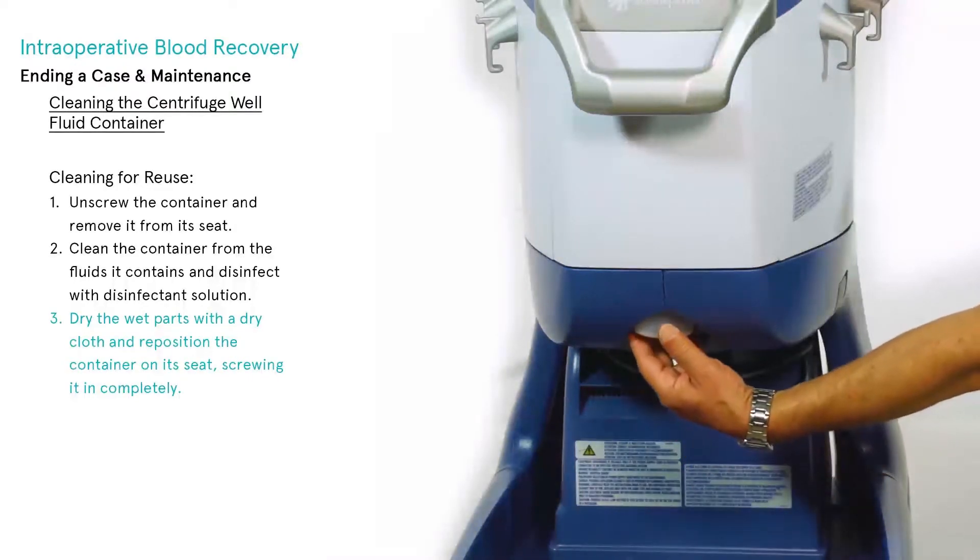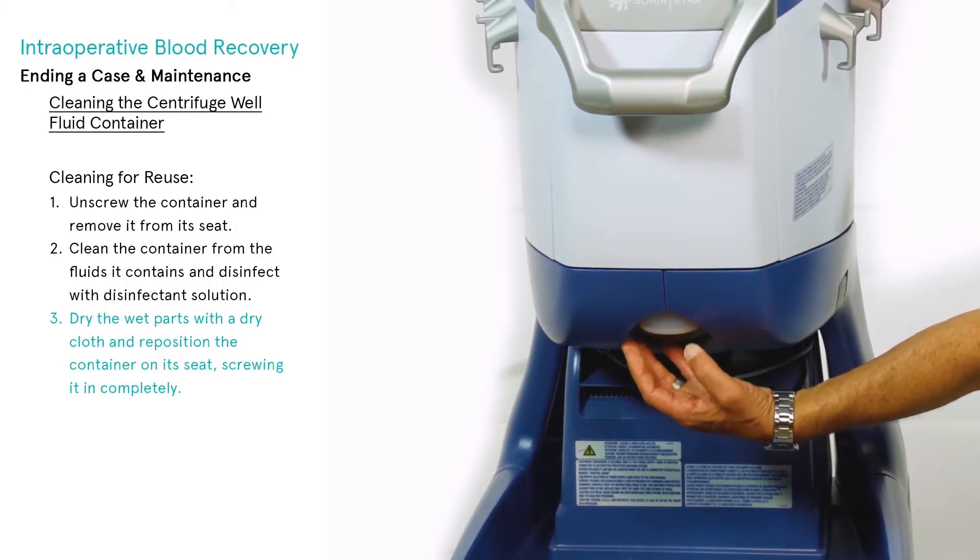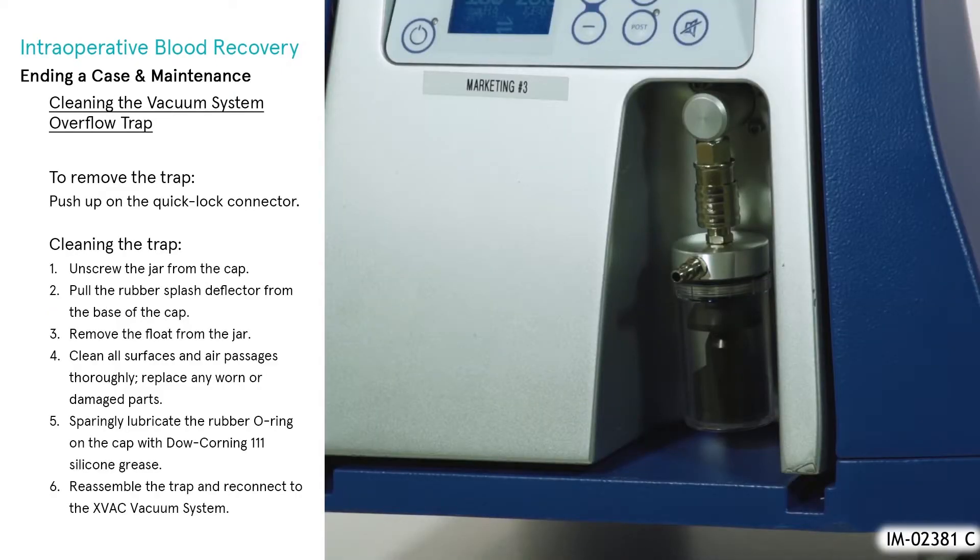Finally, dry the wet parts with a dry cloth and reposition the container on its seat, screwing it completely.